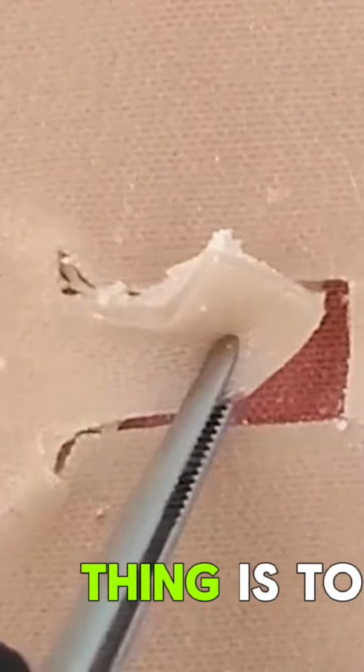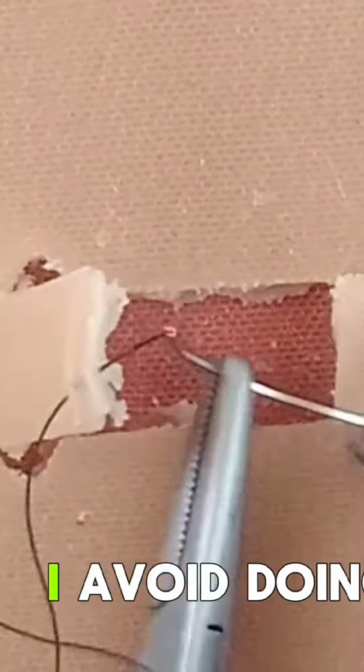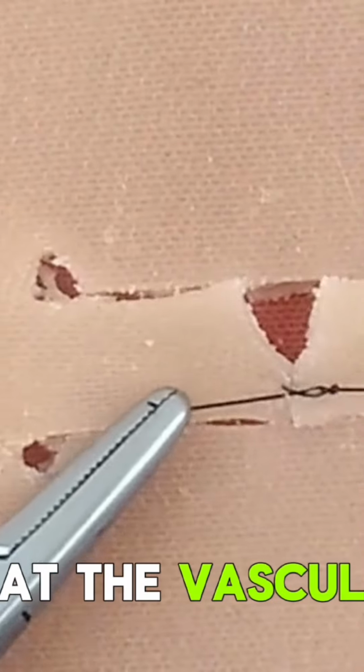The most important thing is to preserve the subdermal plexus, okay? I avoid doing too much undermining. I make the base of the flap wide so that the vascularity is good.